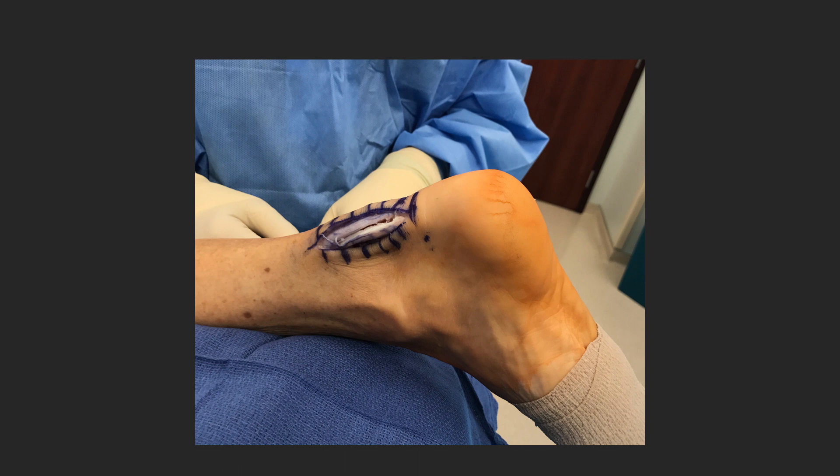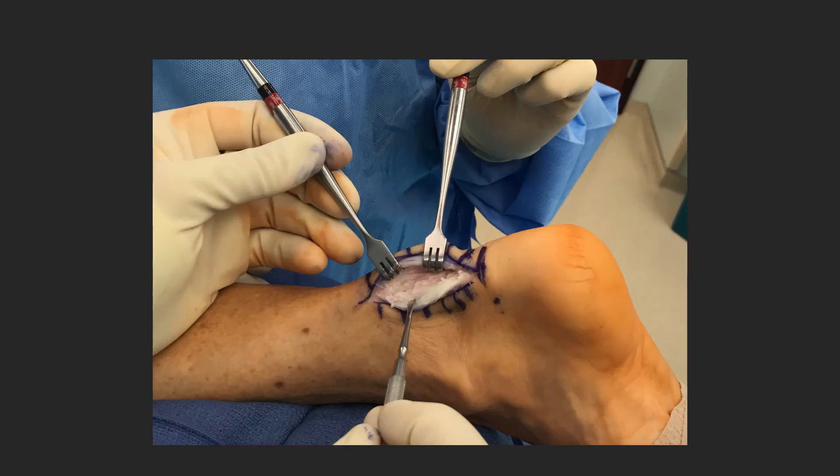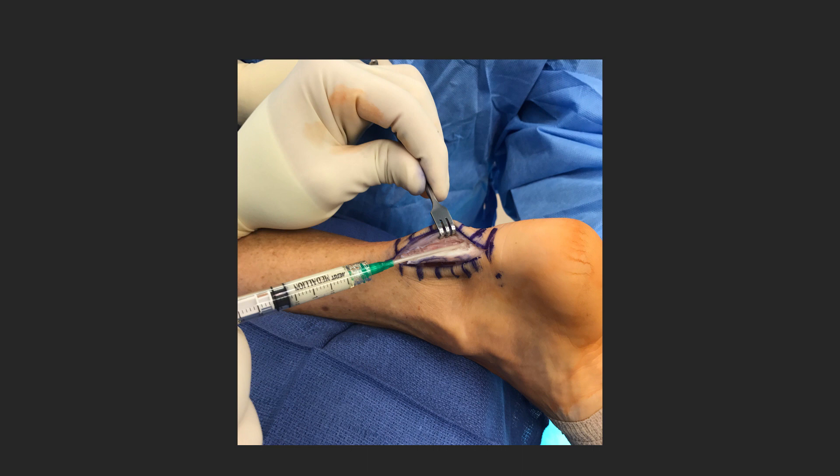Given this and the chronicity of it, certainly a debridement was indicated. Part of the concern is that as we go in, open this meticulously, and clean out all of this diseased tissue, what is going to fill in that defect created — particularly given the very irregular surface that needs to fill in. The use of Interfill in this case, compared to simply getting a platelet plug and fibrin-based scar, uses that Interfill as a basement membrane type scaffold for the cells recruited to the area to heal.